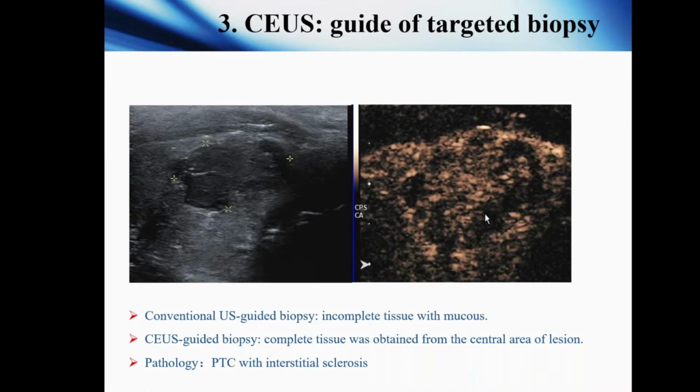So we used contrast enhanced ultrasound to guide the biopsy, and then complete tissue was obtained from the central area of the lesion. The central area is high enhancement shown by CEUS. The pathology of this case was PTC.